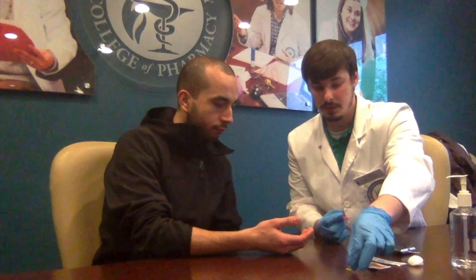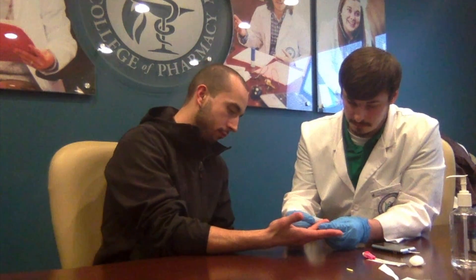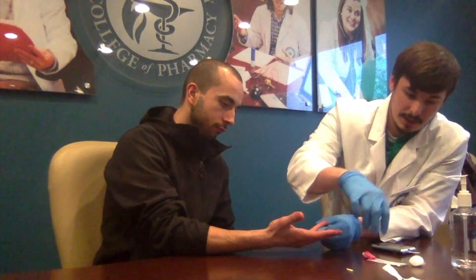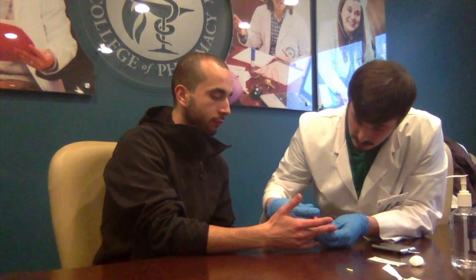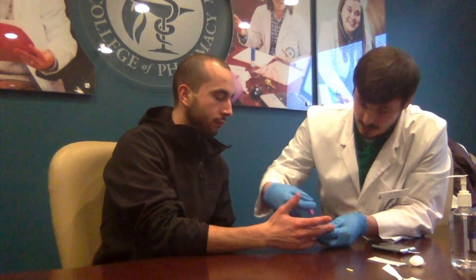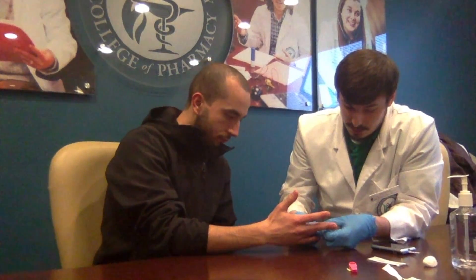Now you take your lancet and pull the little yellow safeguard off. Take the finger that you're going to be testing. What you want to do first is take an alcohol swab and sterilize it. Then you take your lancet and get on the side — that way you're not directly in the center of the finger, so it won't be sore if you go to grab anything. You take it here and just push it in. Once you set it on the skin, you just press it on the clear part. You hear that click — and now we just broke the skin.